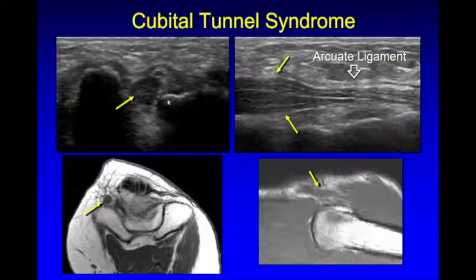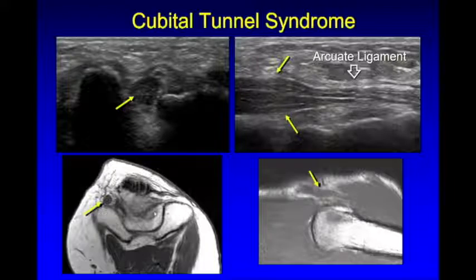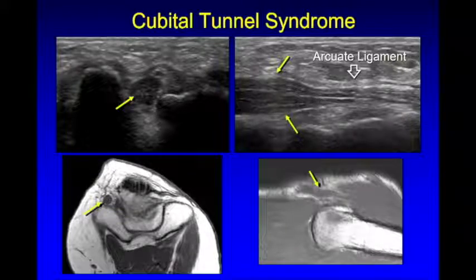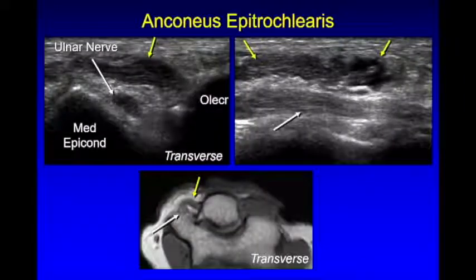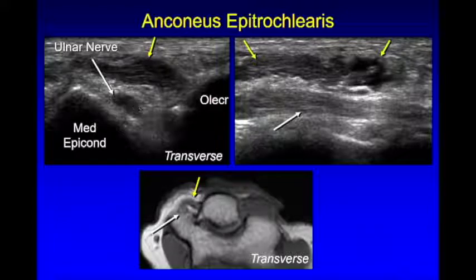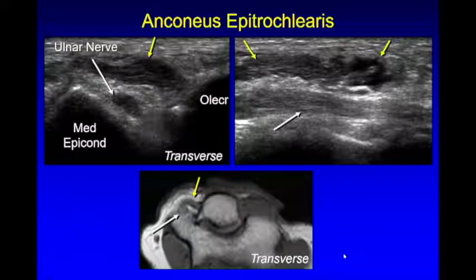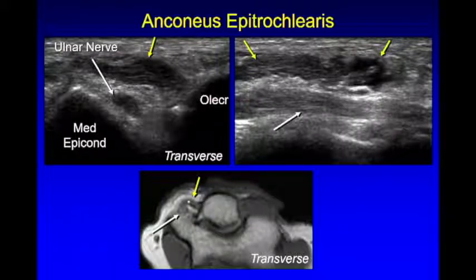Here is a case of an anconeus epitrochlearis. If you have extra muscle sitting here, this normal variant can cause secondary compression. A pitfall is that you can only really identify this muscle with the elbow completely extended, because if you flex the elbow the triceps is pulled up into this space and you cannot differentiate the anconeus epitrochlearis from the triceps. There should be no muscle between the olecranon and the epicondyle with the elbow fully extended. Here is the normal anconeus and here is the accessory anconeus epitrochlearis.